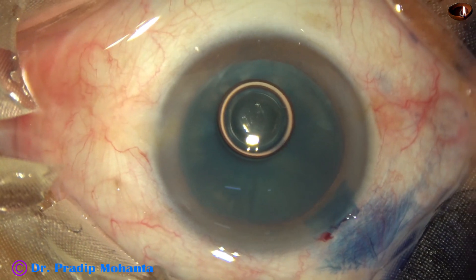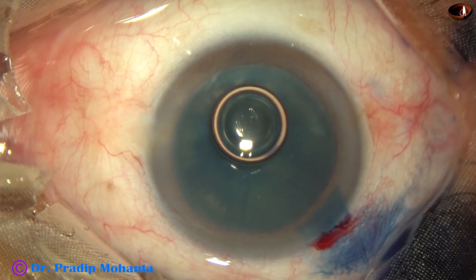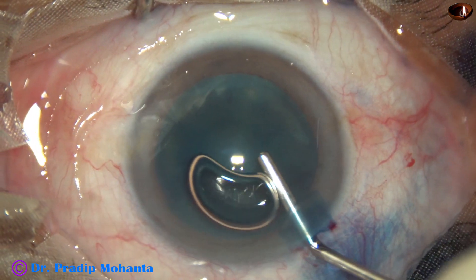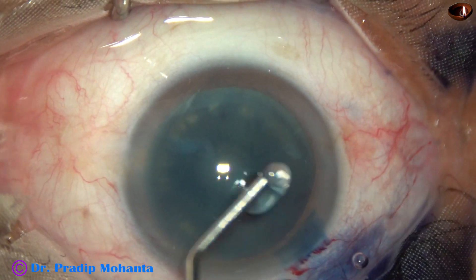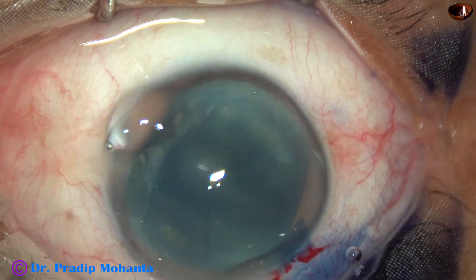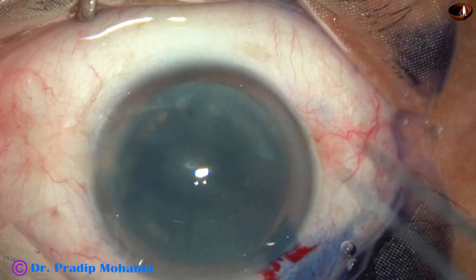So the dye is nicely washed out, and then 2% hydroxypropyl methyl cellulose is injected to fill the anterior chamber. The viscoelastic is also applied over the corneal epithelium, and it improves visibility.